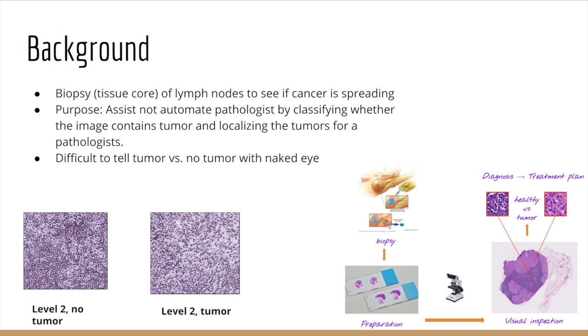Currently, metastasis detection is being performed by pathologists who slice up a biopsy or a volume of tissue and put them on the slide, which are then observed under a microscope to determine whether tissues are cancerous. This process is labor-intensive and very error-prone. Also, there aren't enough experts and they don't have enough time to spend analyzing each tissue.